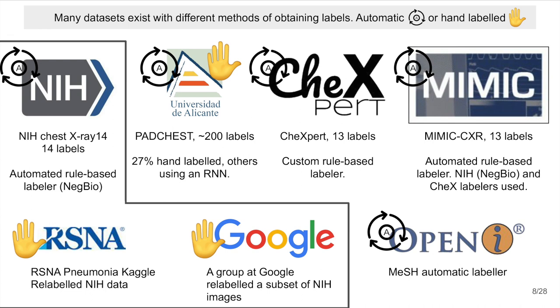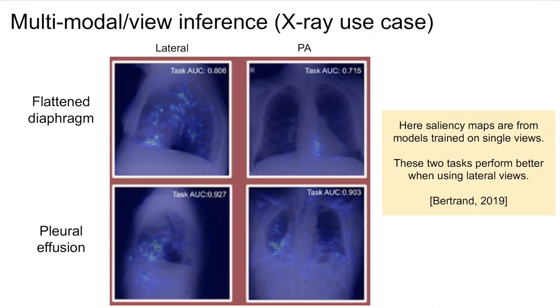Note there are data loaders for all of these datasets in the Torch X-ray Vision Library. One aspect of this domain is that multiple views can be acquired for a patient in one session, and we would like to take advantage of these different views. For example, for the tasks of predicting a flattened diaphragm and predicting pleural effusion, using only the lateral view rather than only the frontal view has been shown to perform more accurately. This implies making predictions from both views would be beneficial.